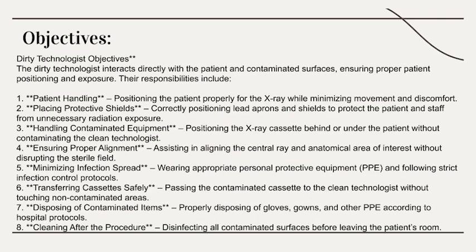The dirty technologist interacts directly with the patient and contaminated surfaces, ensuring proper patient positioning and exposure. Their responsibilities include patient handling, positioning the patient properly for the X-ray while minimizing movement and discomfort, placing protective shields, correctly positioning lead aprons and shields to protect the patient and staff from unnecessary radiation exposure.